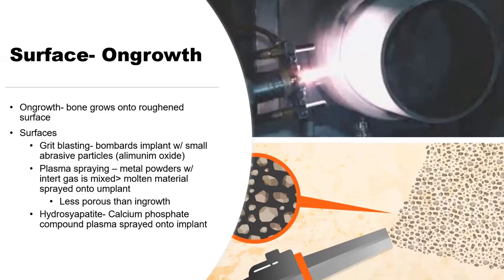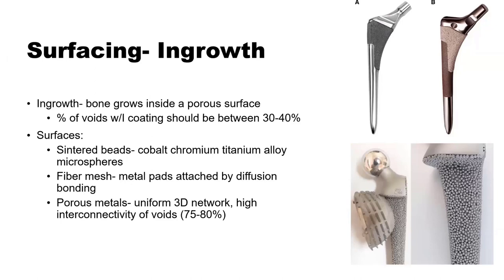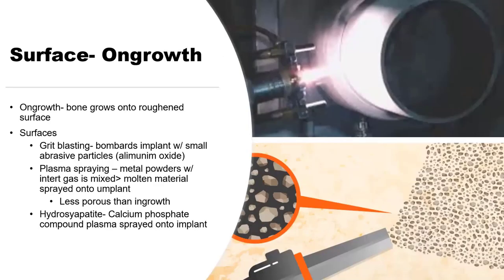And can we quickly touch on grit blasting and plasma spraying? I know it sounds like you're in a sci-fi movie, but it's just different ways of treating the implant. And just to clarify, with ingrowth, the bone goes into the pores of the surface, and with ongrowth, you make the surface itself rough and then the bone grows onto it. Okay. Do I know what machine they use to plasma spray? No, but they treat the surface so that it's roughened and the bone grows on top of it.